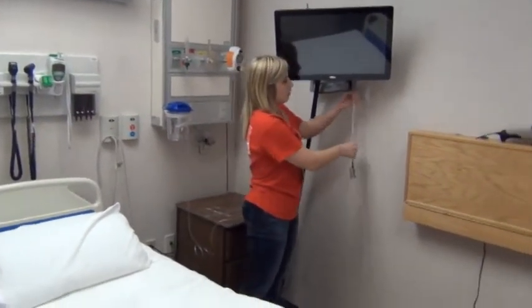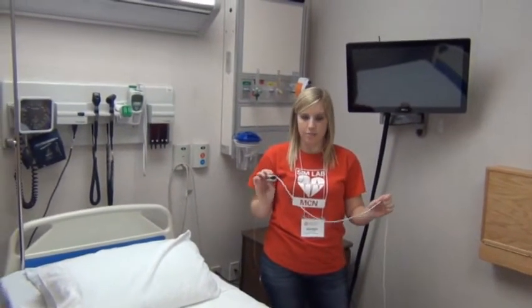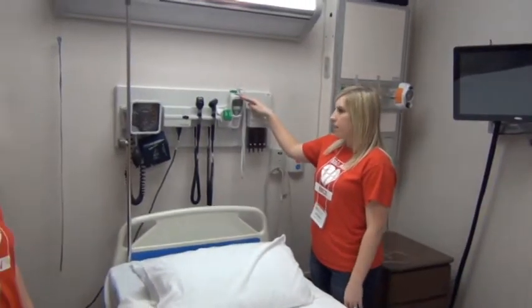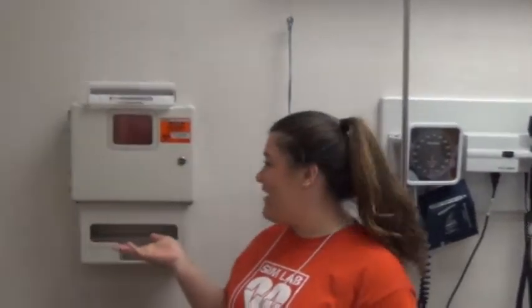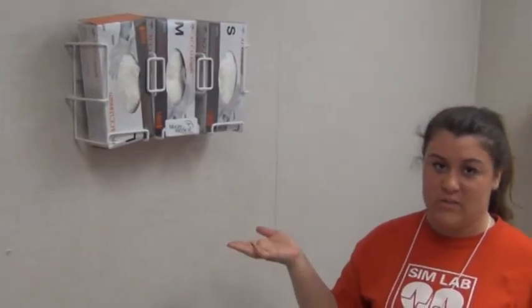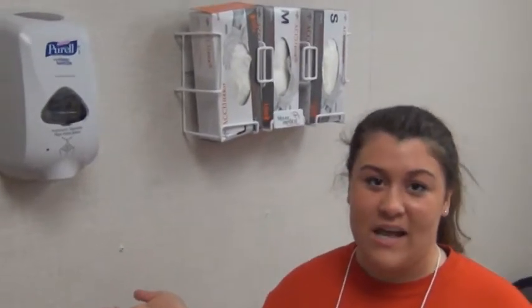Over here we have our pulse ox, which would be used to get any vital signs that you may need. You can use this for the pulse ox. Along with over here, you can use the thermometer to get their temperature, and their blood pressure cuff is right there. And here we have our sharps container. It's really important that any used needles get put in the sharps container to prevent injury. Over here we have gloves. It's always important to remember your gloves in any patient situation that requires them. We have our hand sanitizer. You always want to gel in and gel out. And in some patient scenarios, if it may be needed, you might have to do a full hand washing, which is right here.